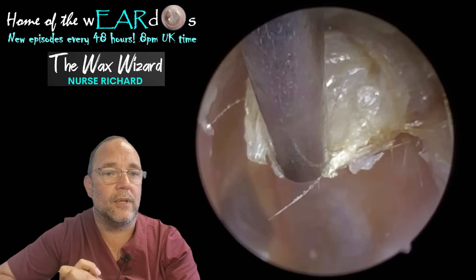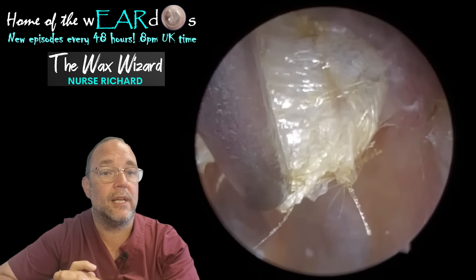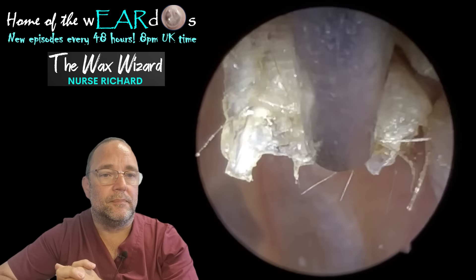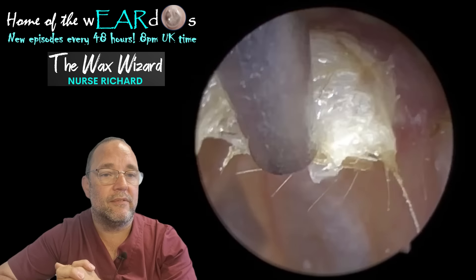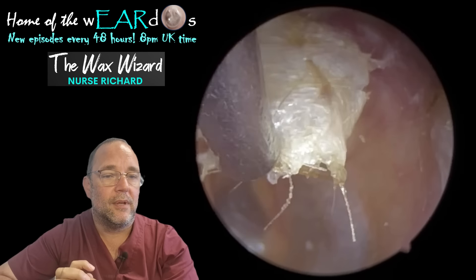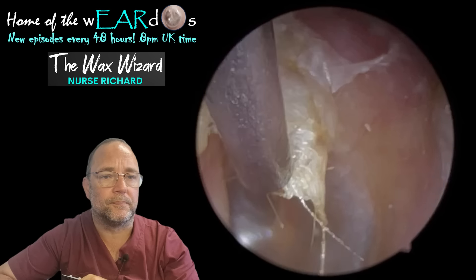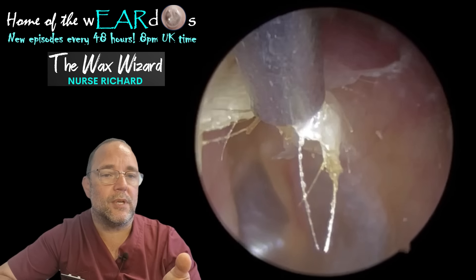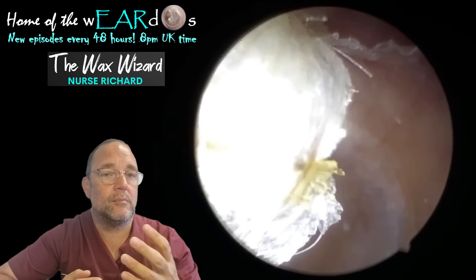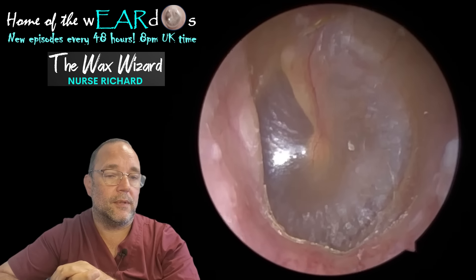To get out of that cycle, it's important to find out what the cause of the itching is to start with. The cause of hers was certainly this thick dead skin in the ear. Usually, steroid creams are very effective at relieving itches — again, depends on the cause — but those can be very effective. For this, it's just obviously peeling it away. She asked how she can manage this going forward — sometimes regular olive oil can moisturize it and make it less dry and itchy. Sometimes acetic acid spray can help to re-acidify the ear and help with the itching. Look at that — nice and clear.